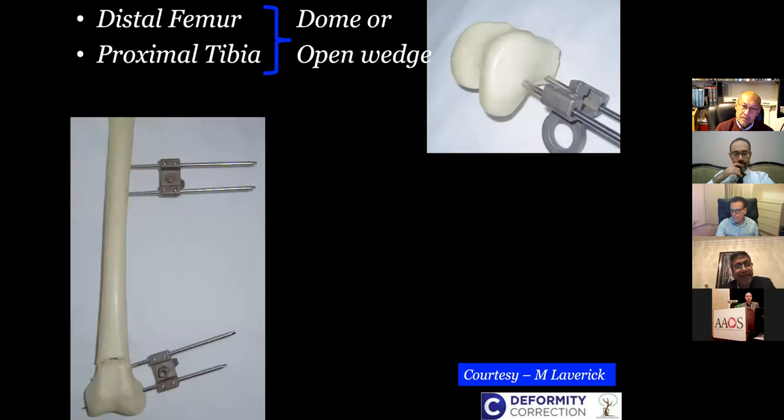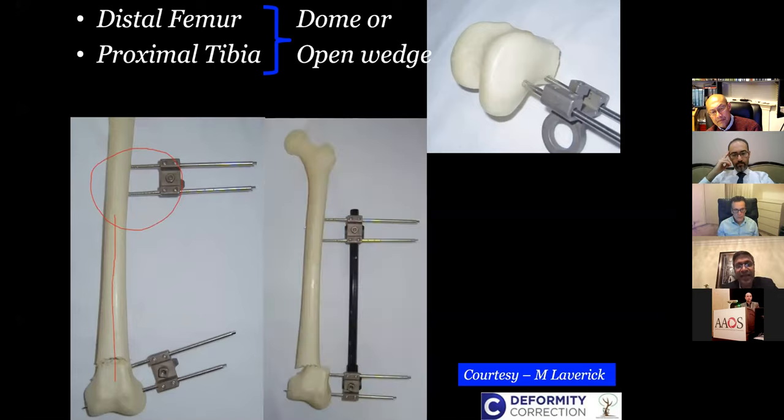And the advantage of that, approximately, if you're going to, your proximal pins need to be far away from the length of the nail or a plate. So for example, in this case, if you're using a nail, your nail will finish somewhere here. So your pins have to be proximal to that. Here, these pins have to be posterior, and you can correct it and then decide where you're going to go. And remember, if you're going to nail it, your entry point may not be the same.